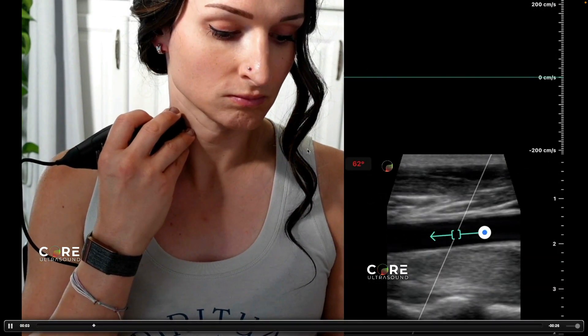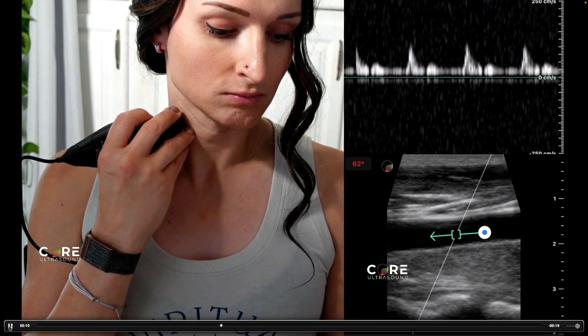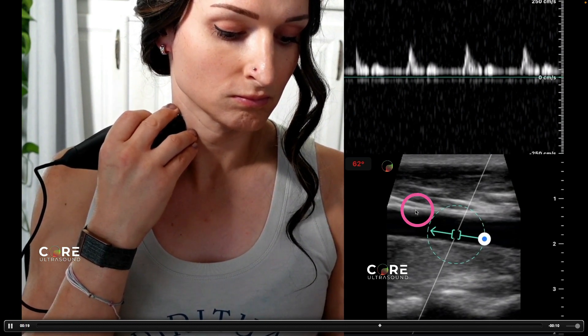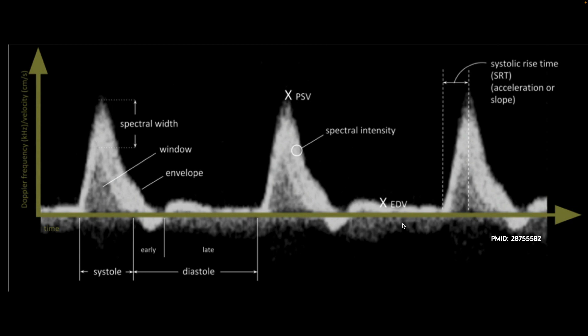Here's a pulsed wave Doppler example using the carotid artery in long axis. The signal is positive because blood is moving in a direction tilted toward the transducer, giving us this positive deflection. If I rotate the transducer 180 degrees — same vessel, but flipped — blood is now moving away from the transducer, giving us a negative deflection. Remember, the Doppler signal is all about directionality relative to the probe itself. For a thorough review of the nuances of pulsed wave Doppler, please check out the referenced PubMed article.